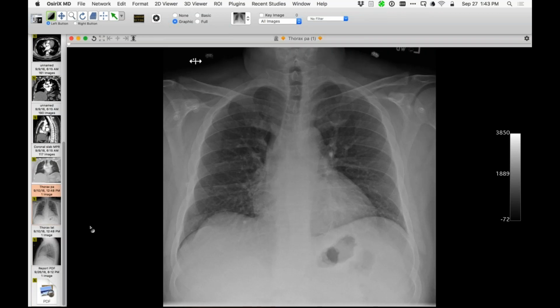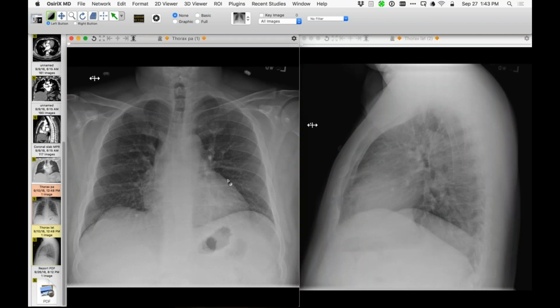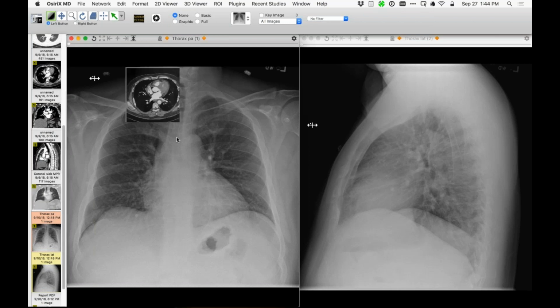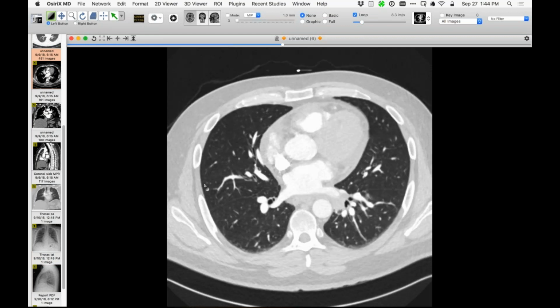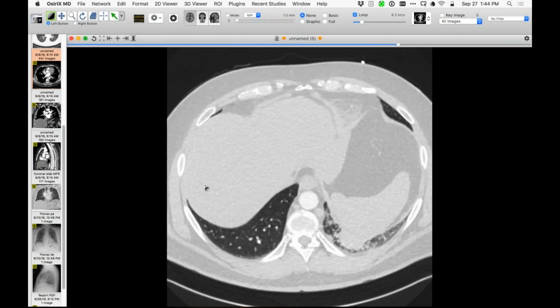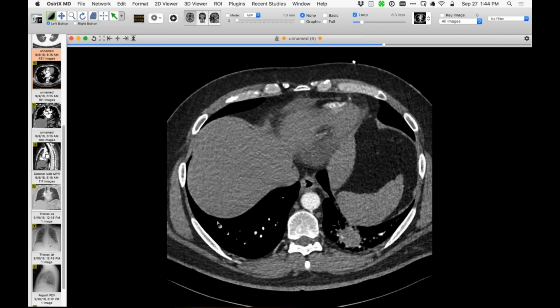And here is one that was done after the CT, which I'll show you in a moment. And I will say that you can stare at this as much as you like, and you won't see anything. So if you had to guess where you might hide something that's more than small, it's going to be in the posterior portion of a lower lobe, somewhere down here. And indeed, that is the case. So let me bring up the CT, which does not show pulmonary embolism, but shows this bigger than small lesion in the posterior basal segment. And that's what it looks like.